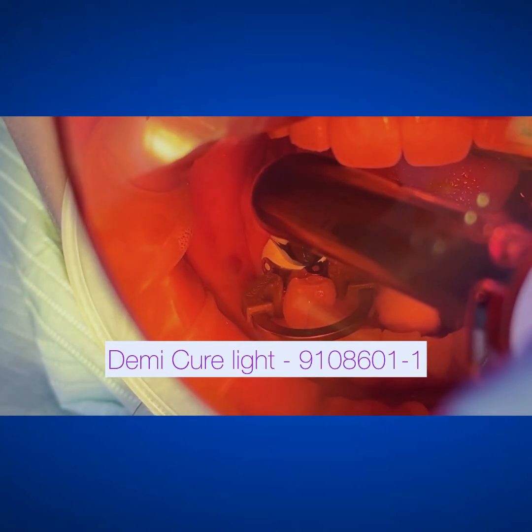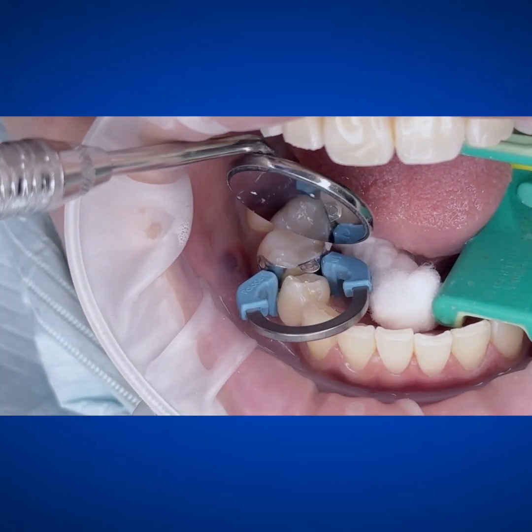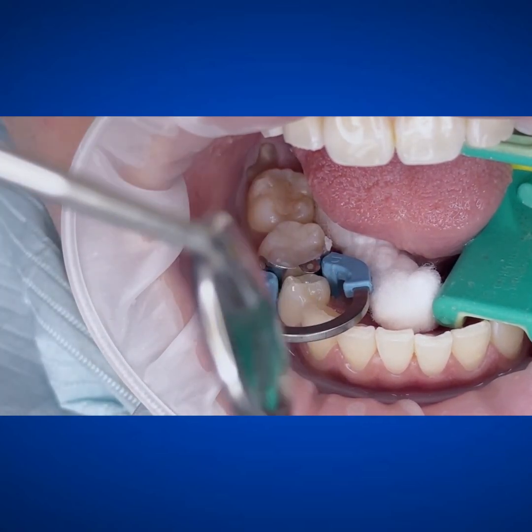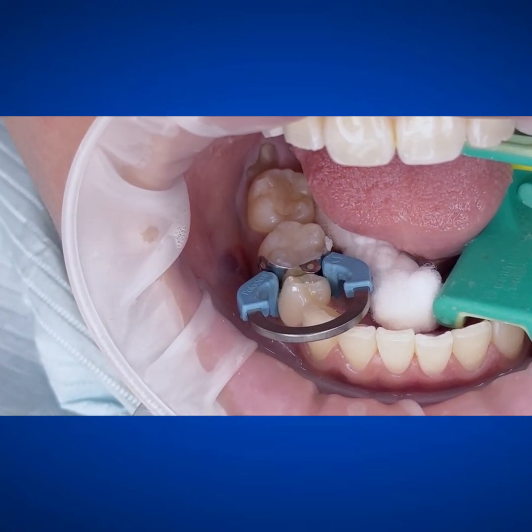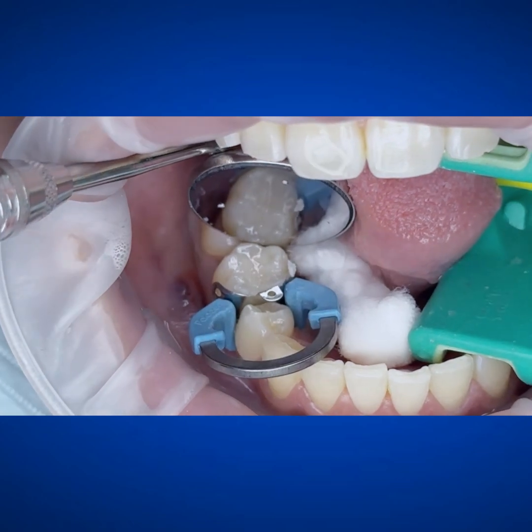This Demi Curelight is amazing. It has a really deep penetration, it can go really fast, and you couldn't really see it in the video, but it does this pulsation of the light to kind of keep the temperature down. And as you can see, we get this beautiful look.